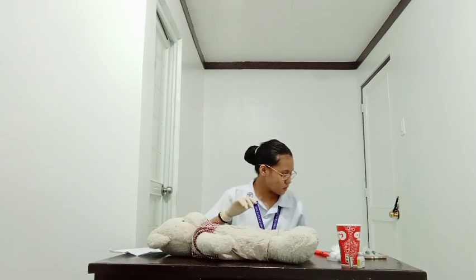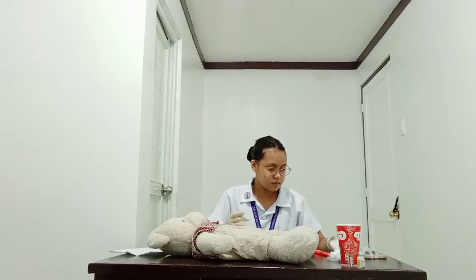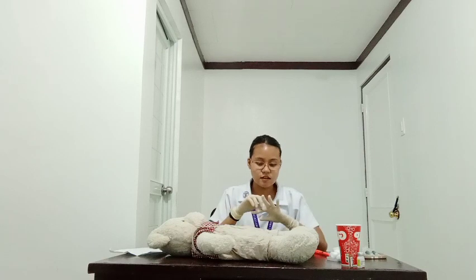Okay. Close the receptacle bin. Transfer and hold the swab between the third and fourth fingers of your non-dominant hand in readiness for needle withdrawal, or position the swab at the client's skin above the intended site. To prevent needle break injury, seeing the needle through the skin serves as a guide to the depth of the insertion. So placing this at the second and third, just like this, in my dominant hand.